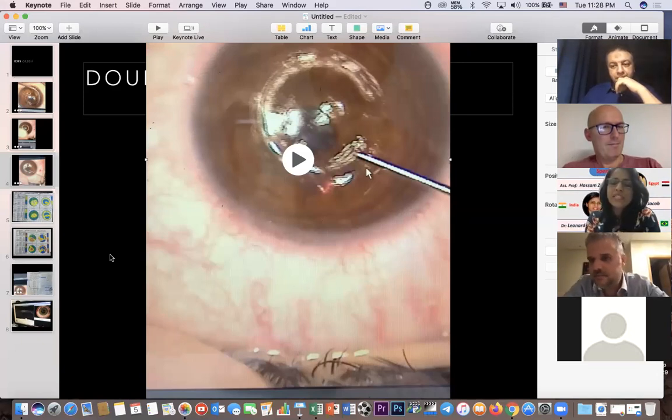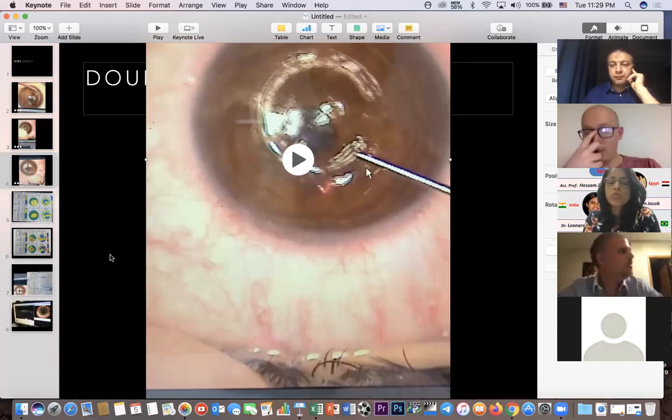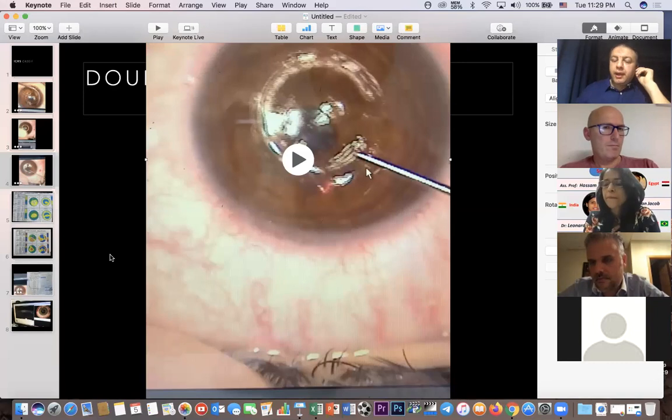Yes, absolutely. I would probably do an ICRS on both of them, but I would push the patient whose vision was not improving, the -2 diopter cylinder, more. I would tell them that the potential benefit for them is much higher. Now, that's not to say that the 5 diopter cylinder will not benefit. That patient is also definitely going to benefit, because 5 is a high power for a cylinder. So provided that both are able to undergo it, I would push both of them, but probably giving more importance to the one where the higher order aberrations are having a greater role in the decreased visual acuity.